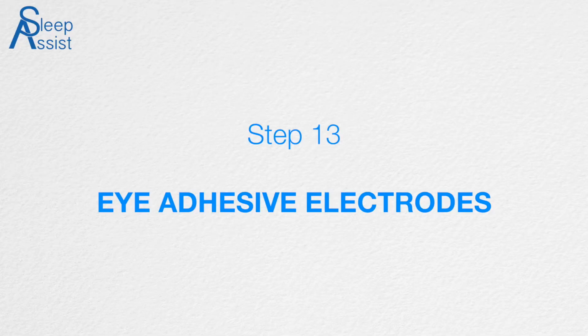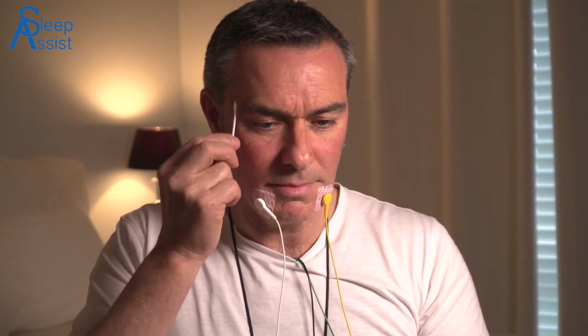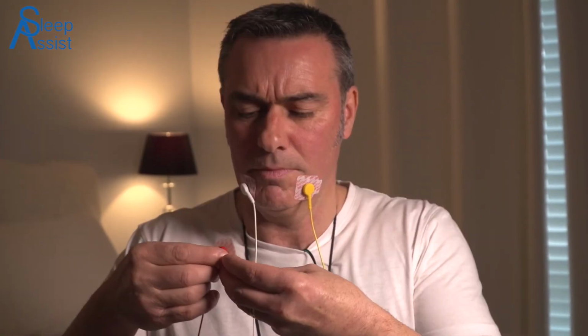Step 13. Eye adhesive electrodes. Using a cotton bud dipped in Nuprep, clean a patch of skin on your right temple the size of a 50-cent piece, rubbing with the cotton bud for 20 seconds. With a fresh alcohol swab, wipe the area clean with one swipe only. Apply the adhesive electrode labelled right eye.